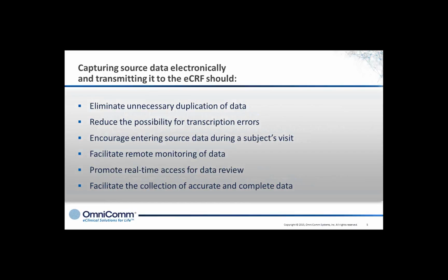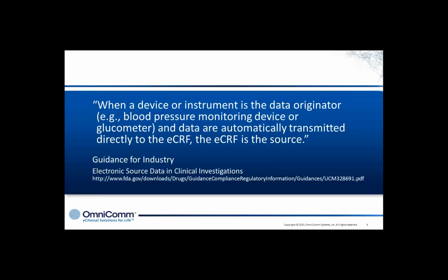One important thing to keep in mind when we were building this integration, and as you use this integration, is that when data is imported from a device such as the Surveyor or eScribe or even the Eli 250 systems, what is imported into the eSource system like Trial 1 is considered the source data.